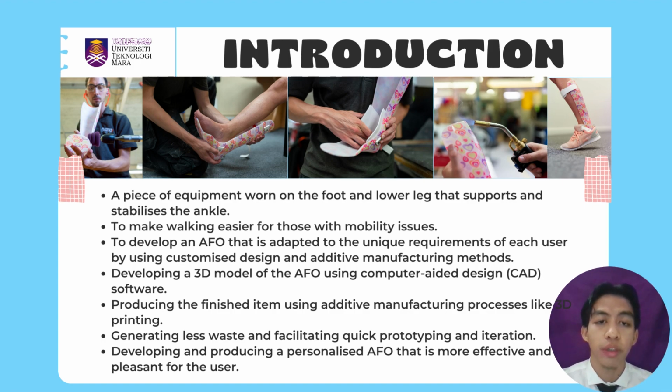The objective of this project would be to develop an AFO that is adapted to the unique requirements of each user by using customized design and additive manufacturing methods. This can entail developing a 3D model of the AFO using computer-aided design (CAD) software and producing the finished item using additive manufacturing processes like 3D printing.